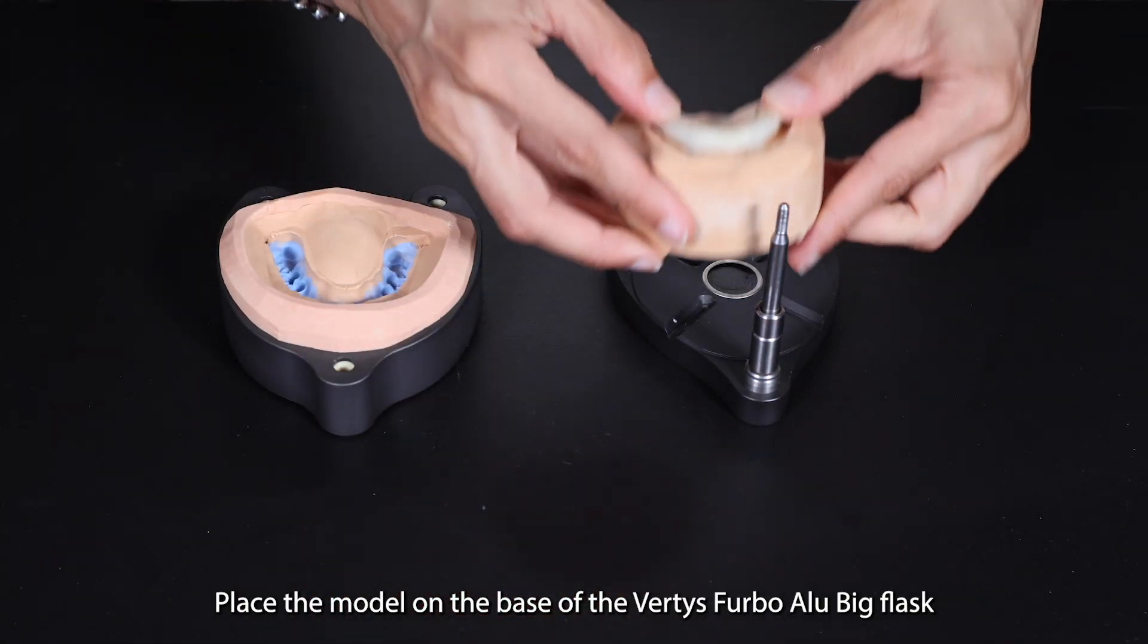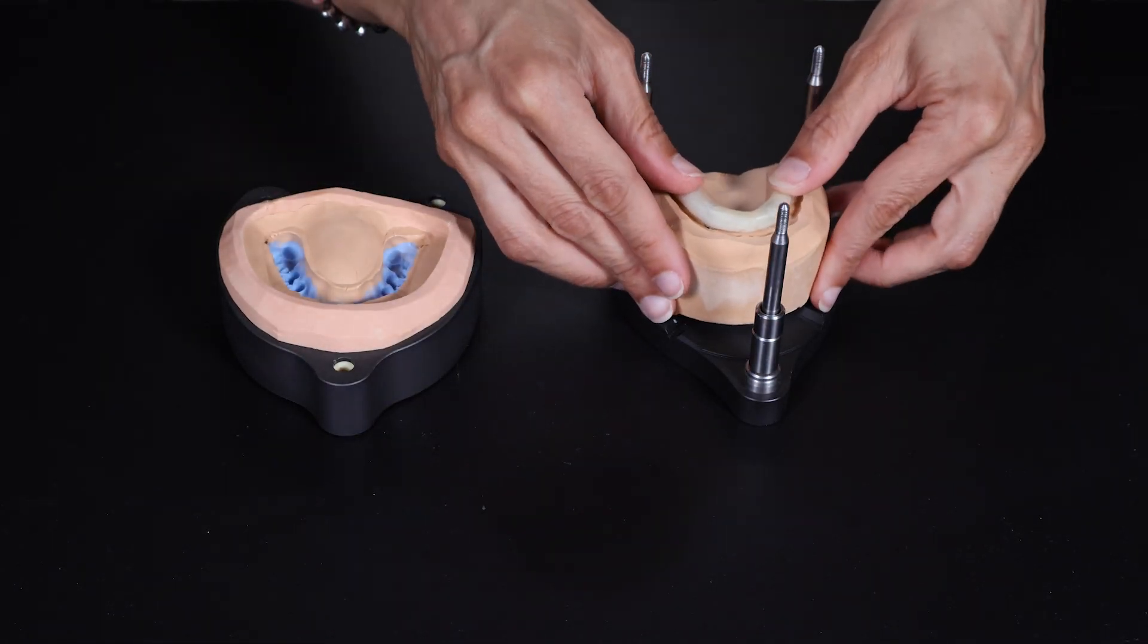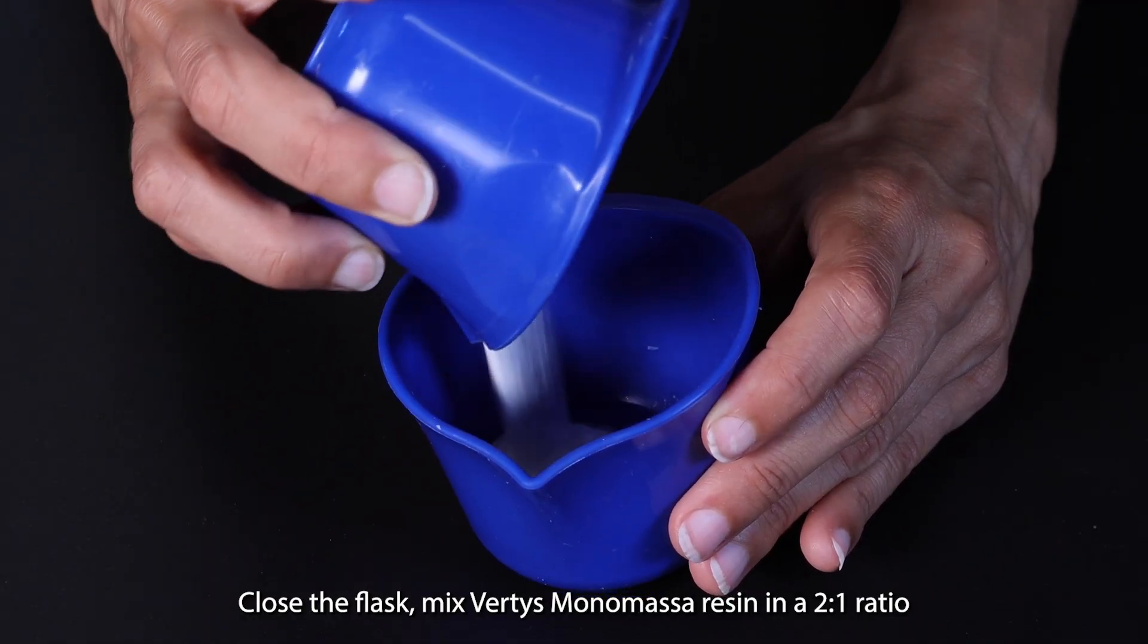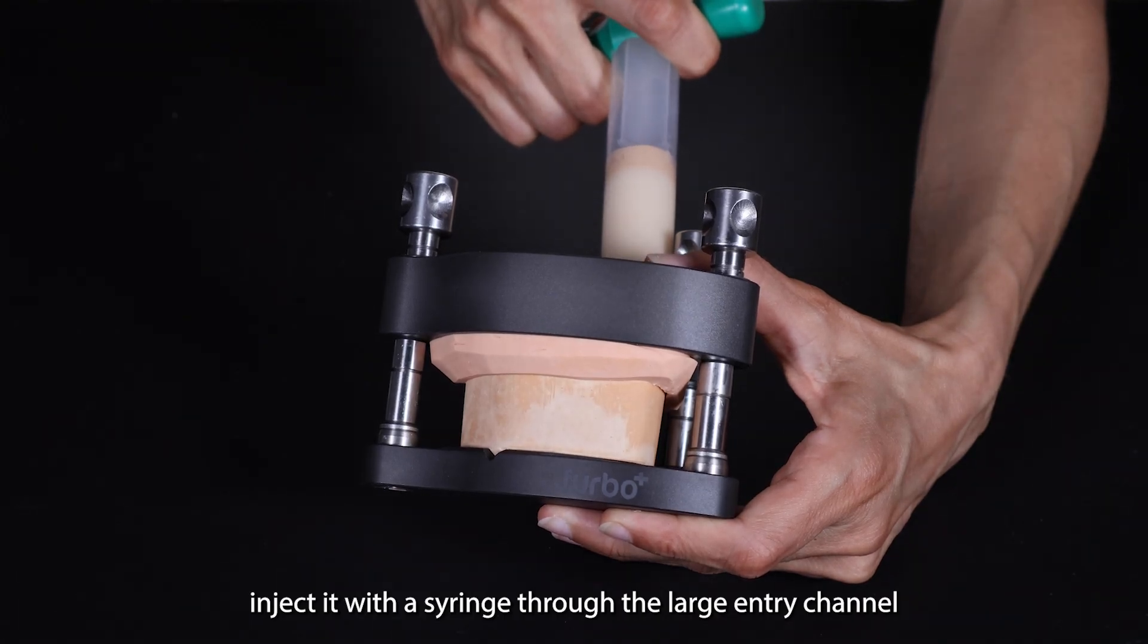Place the model on the base of the Vertys Furbo Alu Big flask. Close the flask, mix Vertys Monomassa resin in a 2:1 ratio, and inject it with a syringe through the large entry channel.